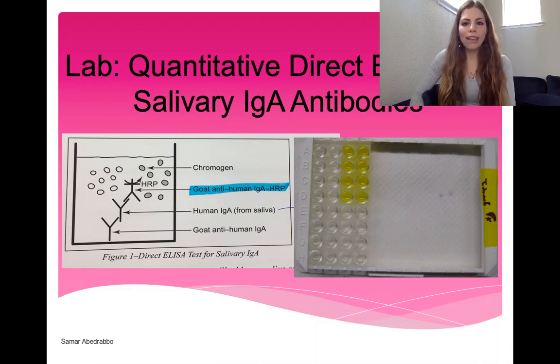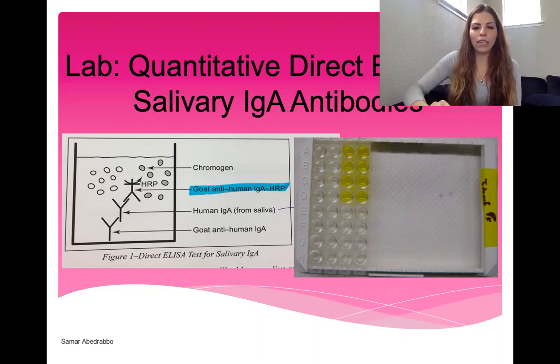So we're going to talk about what the ELISA is, what the lab is, and then in the end I'll talk to you specifically about the test that's being used with COVID-19 infections.